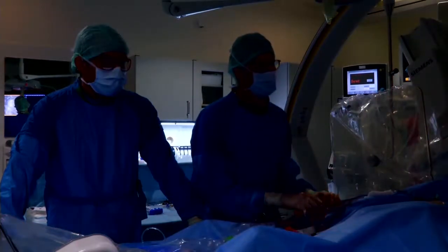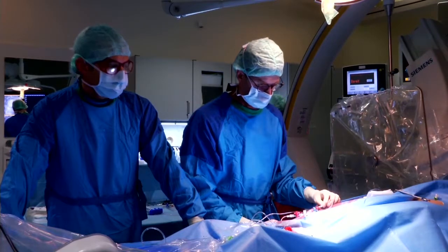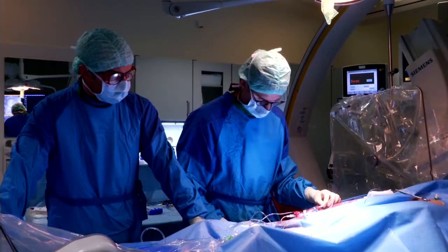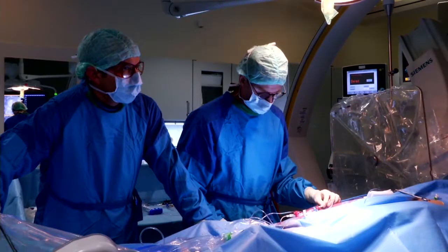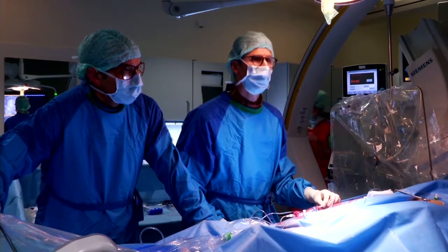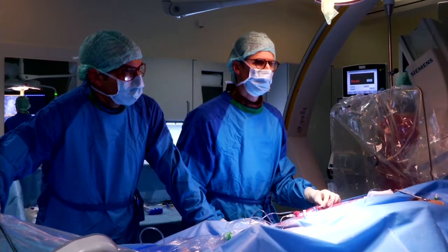Hello, Peter. It's Joe Giovanni here. In response to Ingo's comment, I think if you put the wire in the right subclavian, you get more stability. However, sometimes there is not enough space in the transverse arch for the balloon. So when you inflate it, it will milk down to the descending aorta. I've learned my lessons because I've had that problem, and I've seen it in live cases.